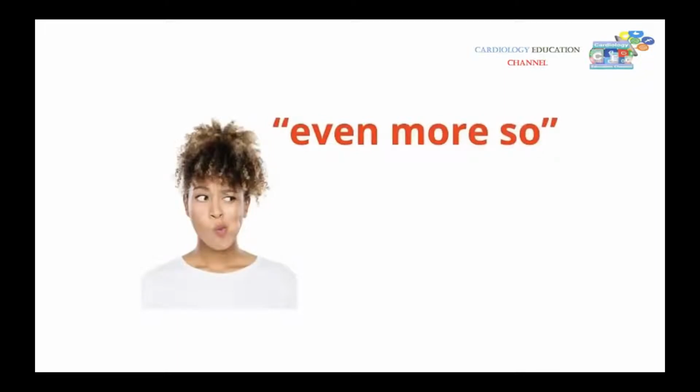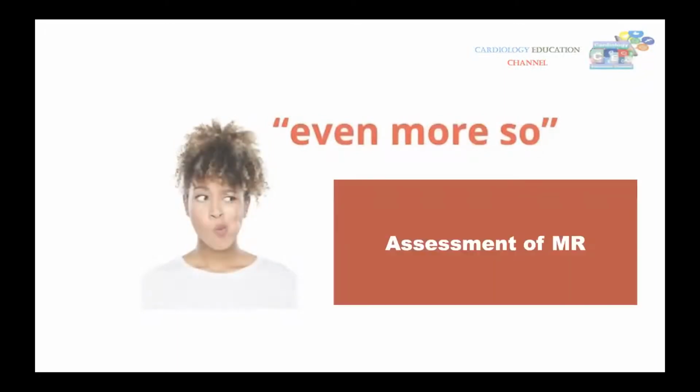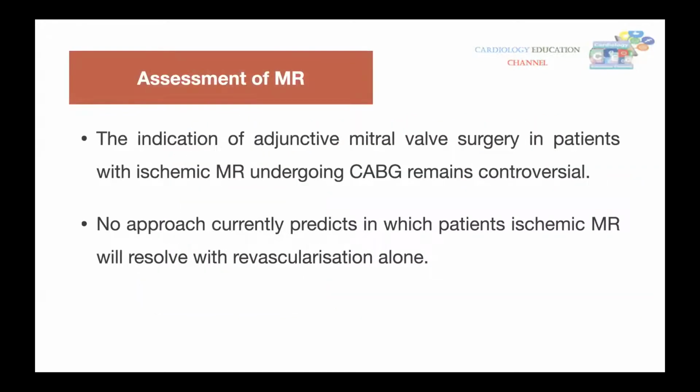But it's not the only benefit of using the dobutamine. You can even assess for the secondary mitral regurgitation, the functional mitral regurgitation or the ischemic mitral regurgitation. And the indication for adjunctive mitral valve surgery in patients with ischemic MR undergoing CABG remains controversial. And no approach currently predicts in which patient ischemic mitral regurgitation will resolve with revascularization alone, except the dobutamine. And this is a very important point for using the dobutamine in patients with significant or borderline mitral regurgitation, where you want to make a decision either to do surgery or whether it will improve with revascularization alone.